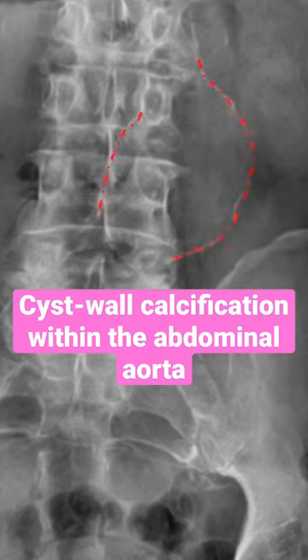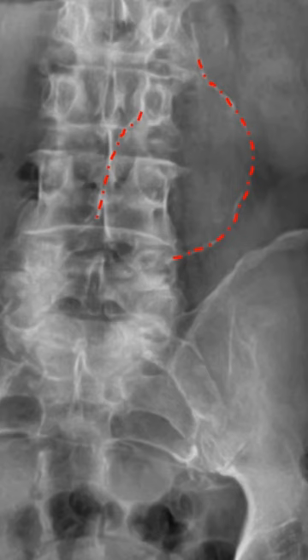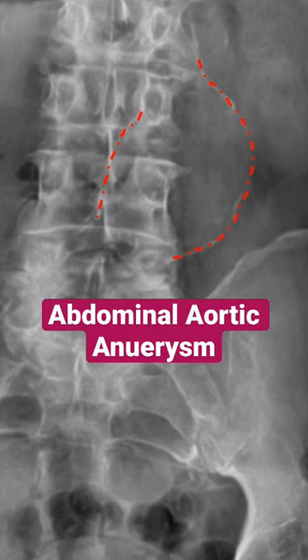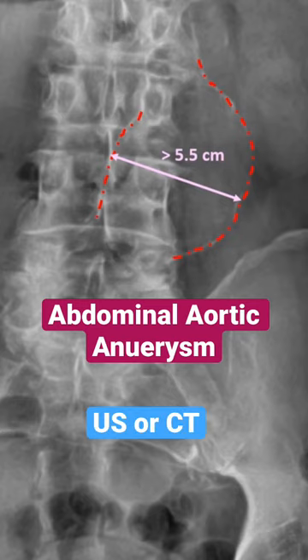Any time you see this on a frontal image, double check the measurements to assess for dilatation of the abdominal aorta. Any enlargement over 5.5 centimeters should be assessed appropriately with ultrasonography or CT.